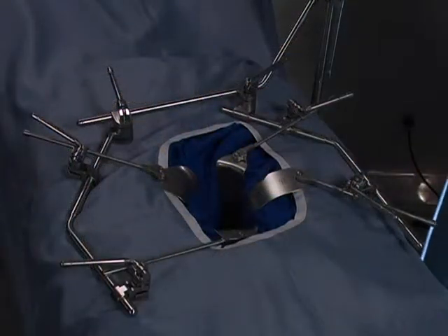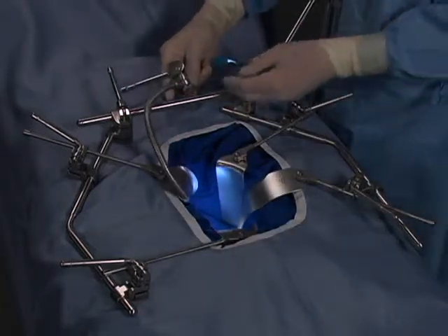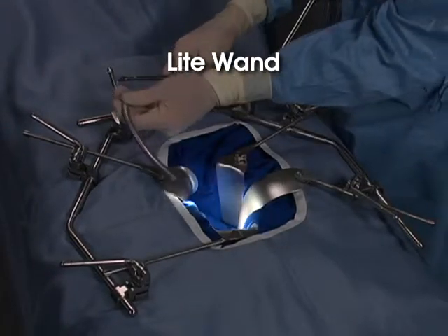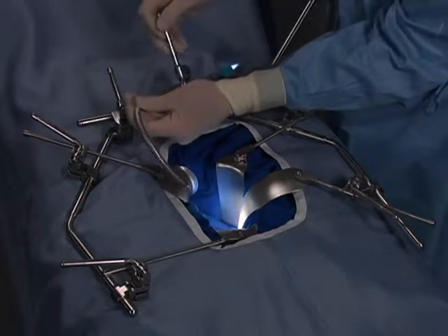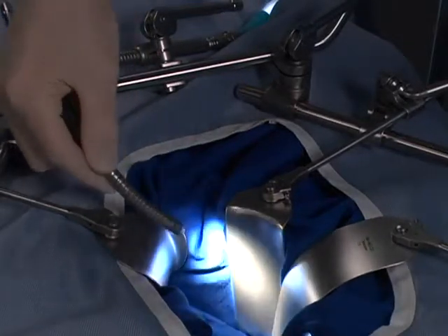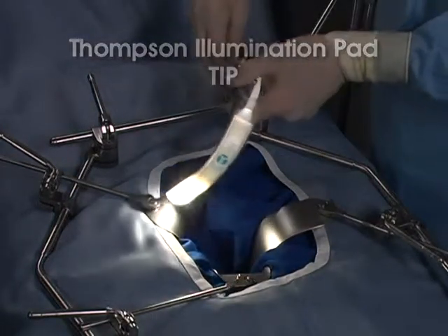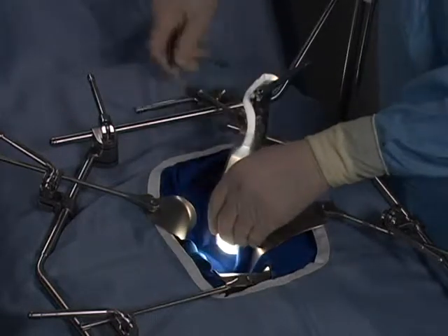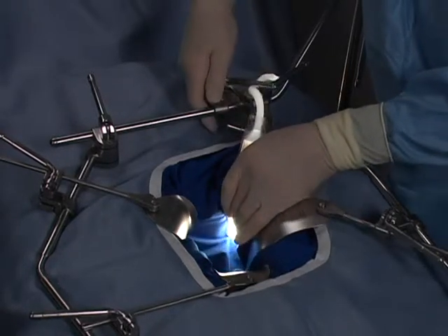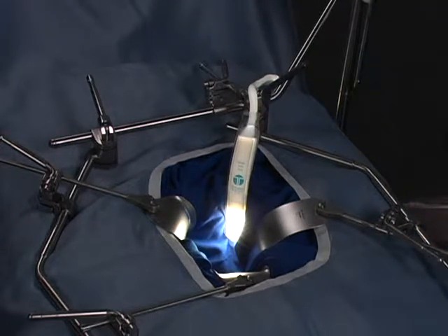Along with the Thompson retractor's phenomenal exposure, we offer two options for bringing cool, bright light into the incision for even greater visibility. The Thompson light wand is a reusable light that can be attached anywhere on the Thompson frame with its quick-locking clip joint, and light is directed as desired by adjusting the malleable light. The Thompson illumination pad, or tip, is a single-use light that slides over any one-inch wide retractor blade. The retractor blade is then placed, providing both exposure and cool light within the incision. Both the Thompson light wand and the tip eliminate the need for a headlamp and enhance visibility.